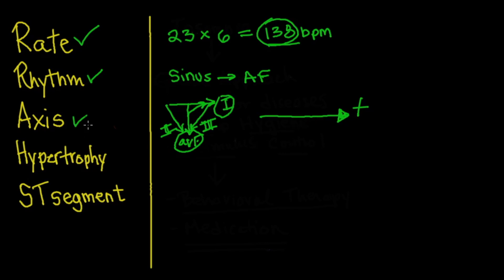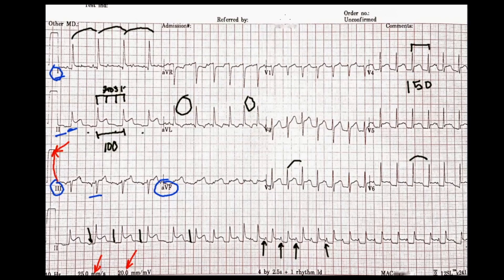Now let's look for hypertrophy across all four chambers: right atrium, left atrium, right ventricle, and left ventricle. For right atrial enlargement, we look for peaked P waves in lead II — we don't see that. In V1, we look for a large upward deflection with a small downward deflection in the P wave — we don't see that either. For left atrial enlargement, we'd expect a small positive and large negative P wave deflection in V1 — also not present. So there's no evidence of right or left atrial enlargement.